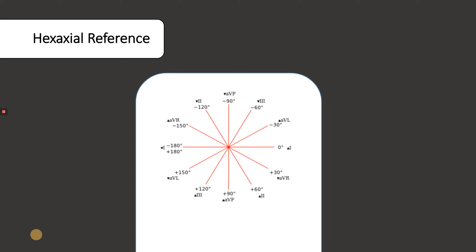Whether I have more muscle, so essentially more electricity, to really simplify it, it's going to pull it in one direction or the other, or the pacemaker cells are blocked off in a certain direction. So basically, the heart has to take a detour to depolarize everything. So a lot of criteria for different diseases use this as a point of criteria. Like, it should be deviating to the left or right if they have this particular condition. So it's important you know how to read and find that.